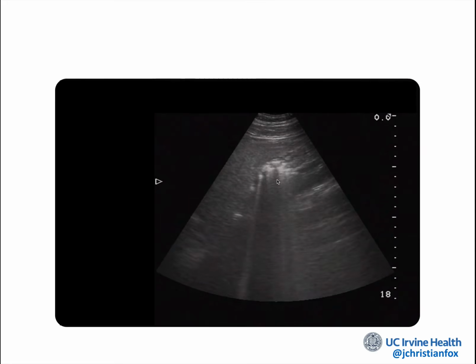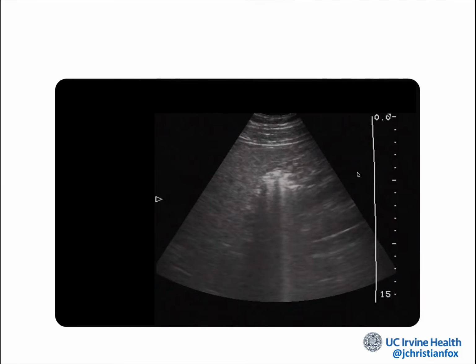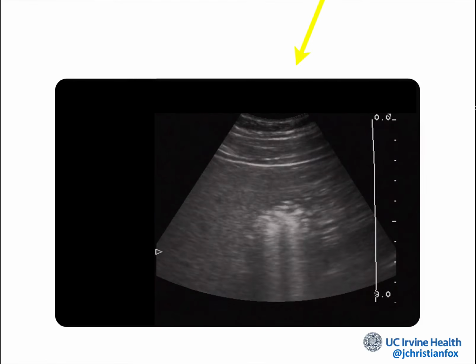Nope, that's not a WES. A WES is a contracted gallbladder wall echo shadow. That's not what this is. This is just the duodenum, normal looking duodenum.